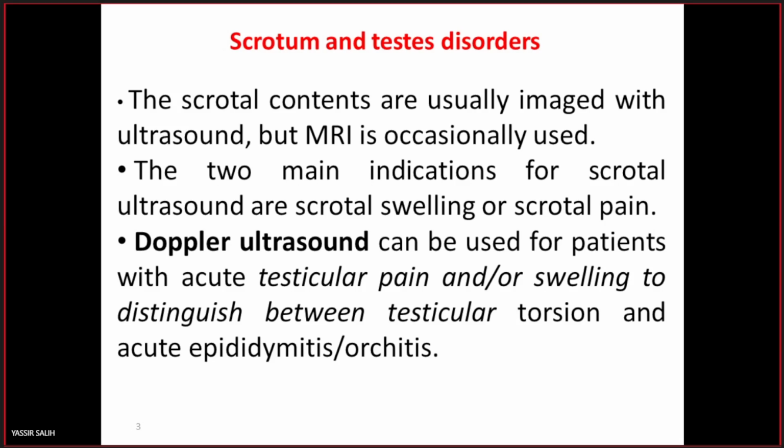But sometimes MRI may be used when the ultrasound result is inconclusive. The main indication for scrotal ultrasound includes scrotal swelling and pain. These are the commonest indications for ultrasound: scrotal pain or scrotal swelling.